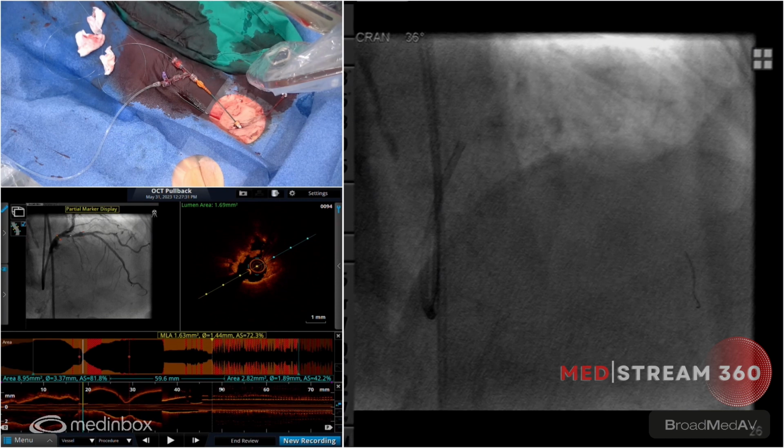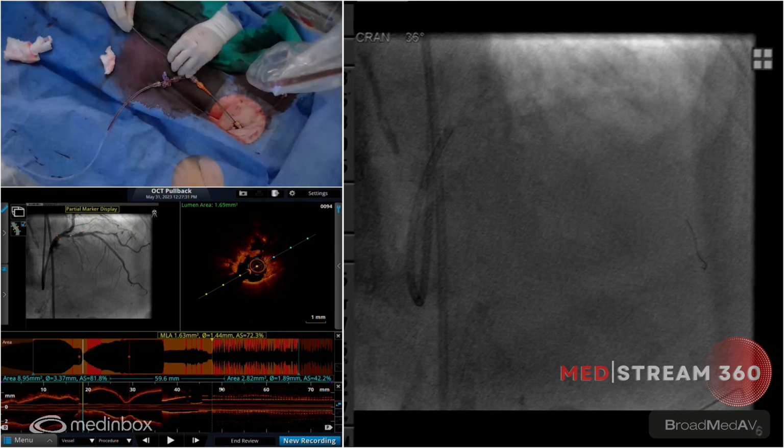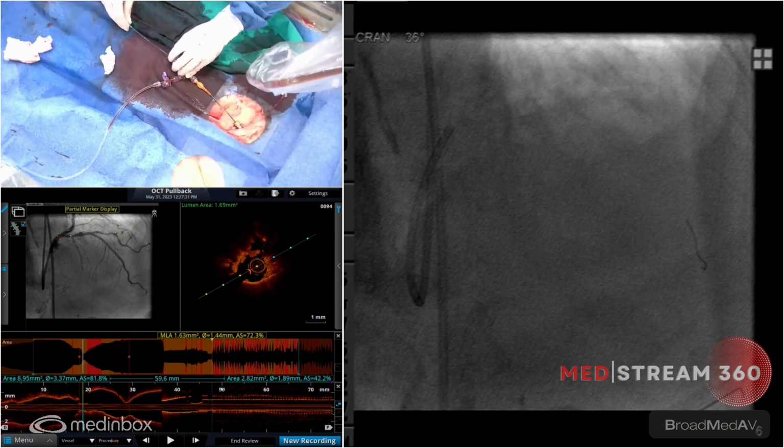Oops, sorry. Arjun, you've done this before, I'm assuming? Yeah. Okay. I'll let you put this on. Are we going with the better eyesight? Yeah, he's younger. He's got better eyes. I can't see. I don't know if my focal's on. You steer for the old system. Get out of your way here. 161. We'll accept it. Glide is dripping.